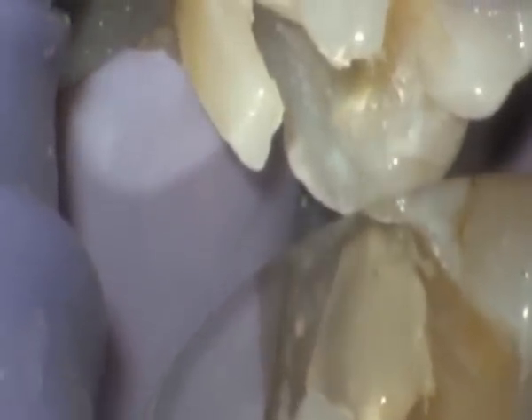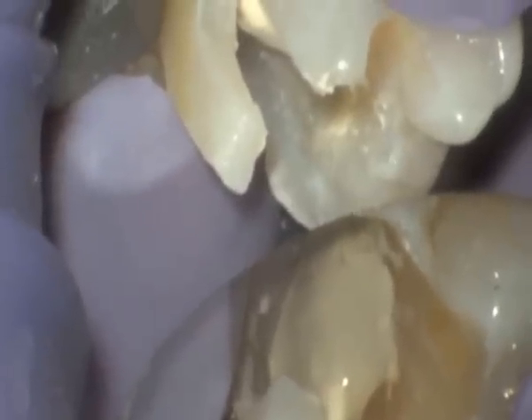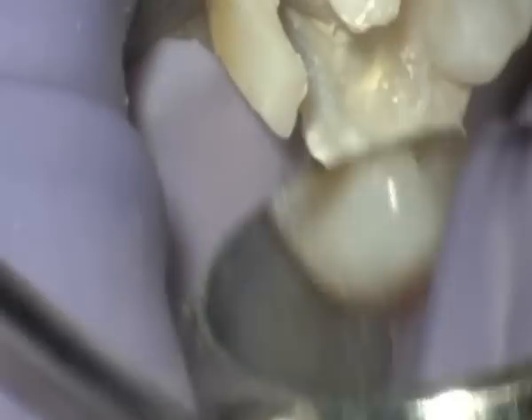This layer of biodentine was then allowed to set for 10 minutes. A second mix of biodentine was then used to bulk fill the cavity to act as a temporary filling.